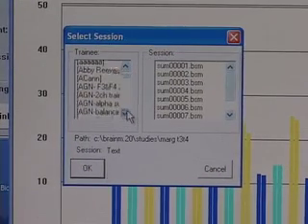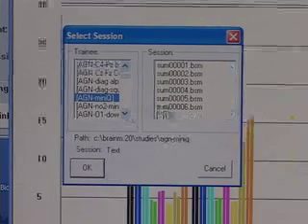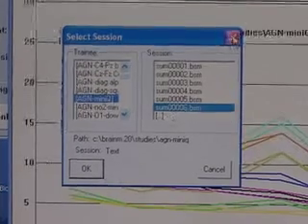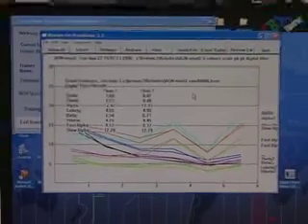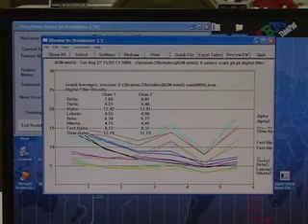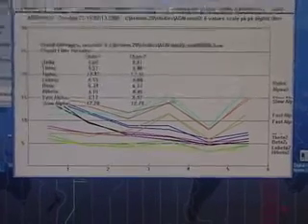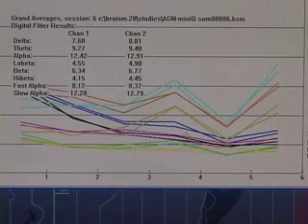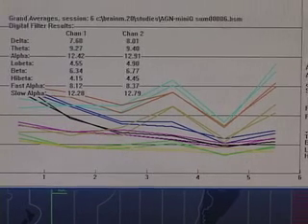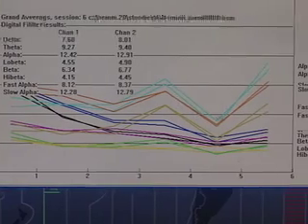And I apologize, I'm taking a moment here. Okay. And here is a mini-Q assessment on a client. And again, while we're looking at this screen, I want you to look at this very carefully. Do we notice that the line for alpha is light blue? Do you notice all the lines are fairly parallel and even? Do you see the shape of this? Up and down and up.